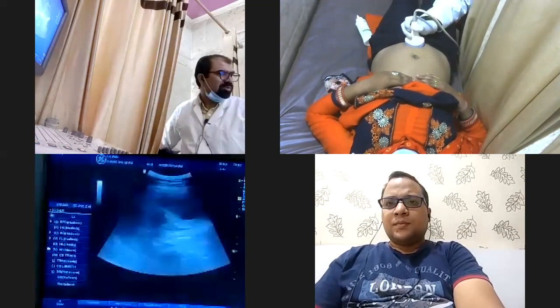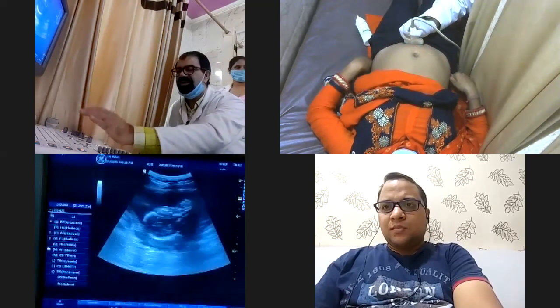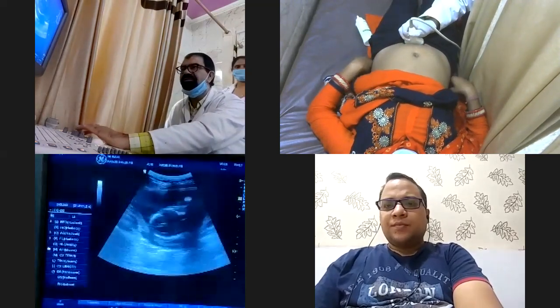Now see what I am doing. This is transverse. Yes or no? This is transverse. Of course this is a fetal ultrasound.